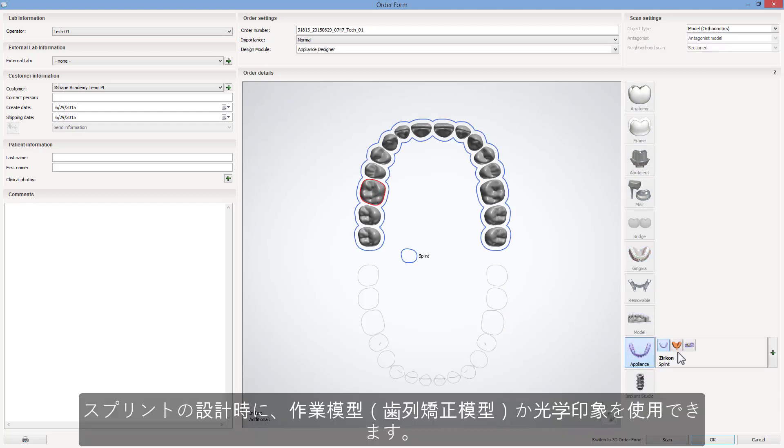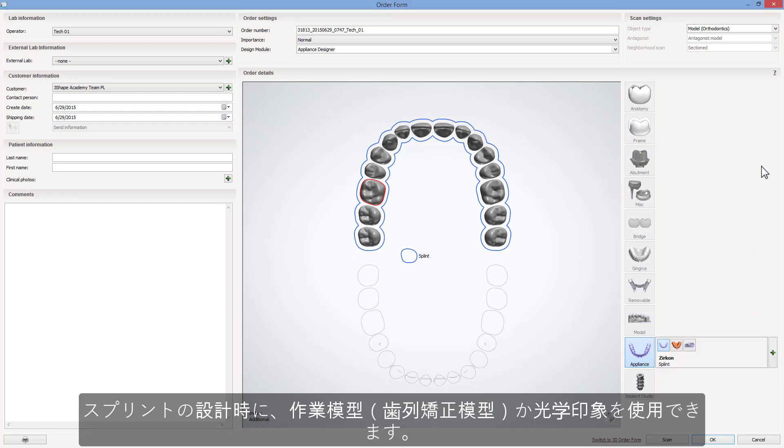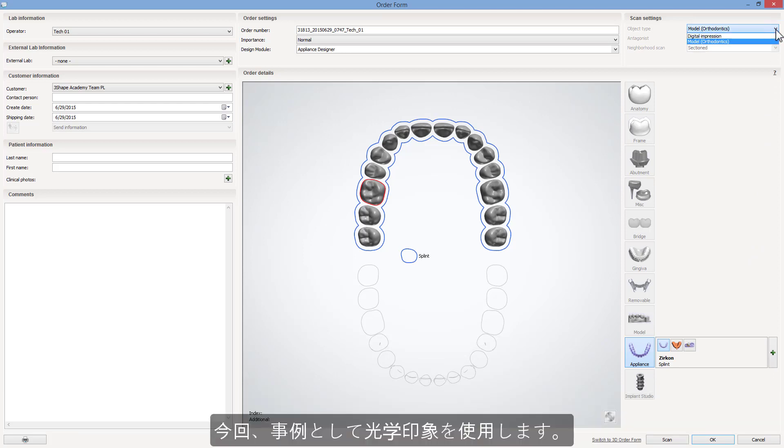While designing a splint, you have an option to work either with orthodontic model or digital impression. In our case, we used digital impression.